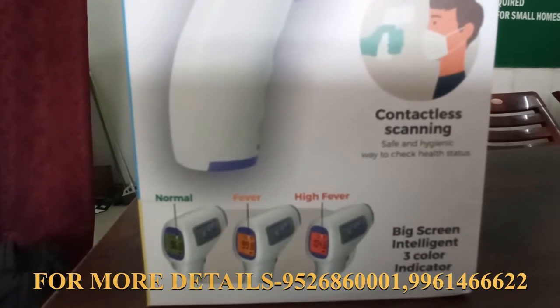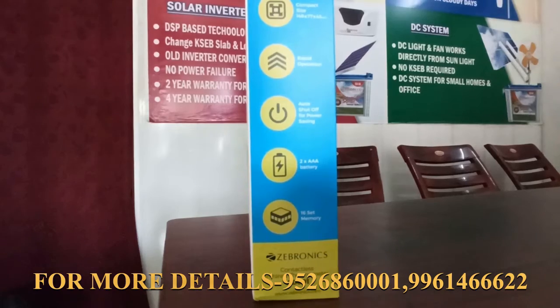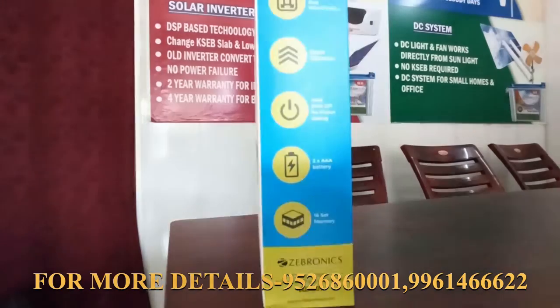There are three colors in the display mode. The colors indicate: normal temperature, fever, and high fever.